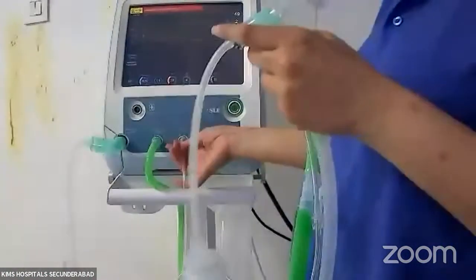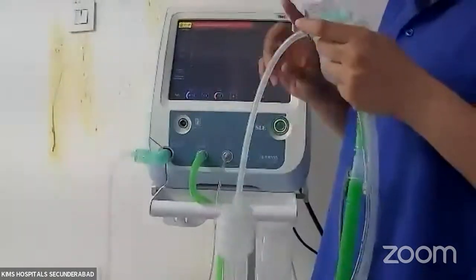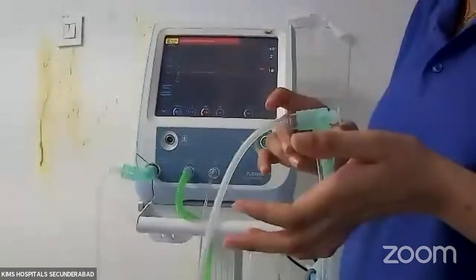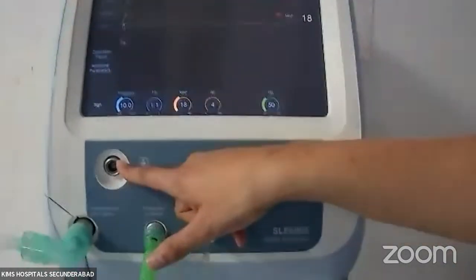The proximal airway pressure line should be connected even with high frequency ventilation, because we will need this to monitor the delivered pressure. There is an option of using high frequency with volume guarantee in Draeger ventilators, and this is also an option, in which case we will also be connecting the flow sensor here. So this is the knob for connecting the flow sensor.